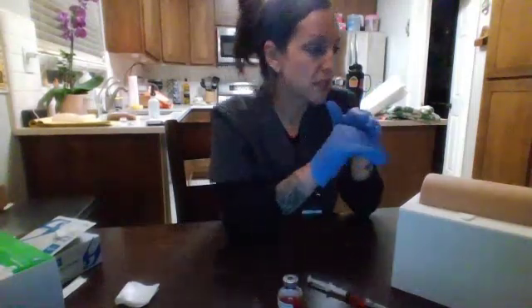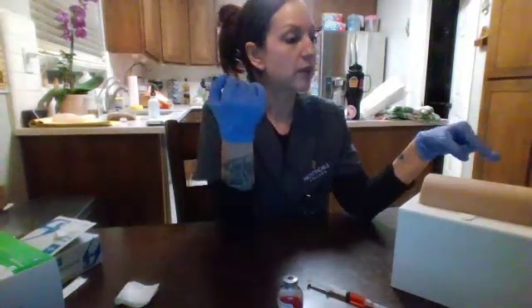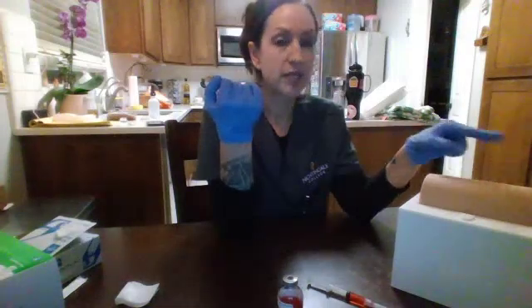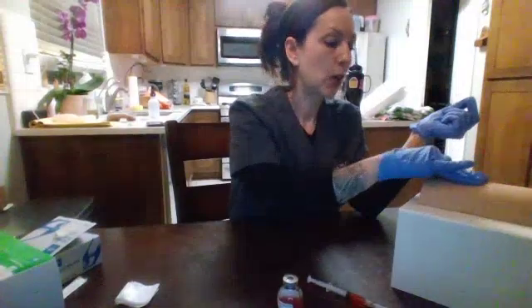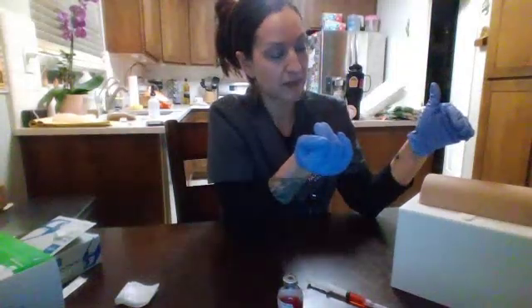I'm going to assess the patient's skin and the integrity of the muscle. I'm going to look for any skin irritation. I'm going to look for bruising or any edema. I'm also going to assess for any irregularities or abnormalities, palpate for any tenderness or hardness. If there are any abnormalities noted, then I would rotate using a different site. Likewise, if it has been frequently used for another injection.